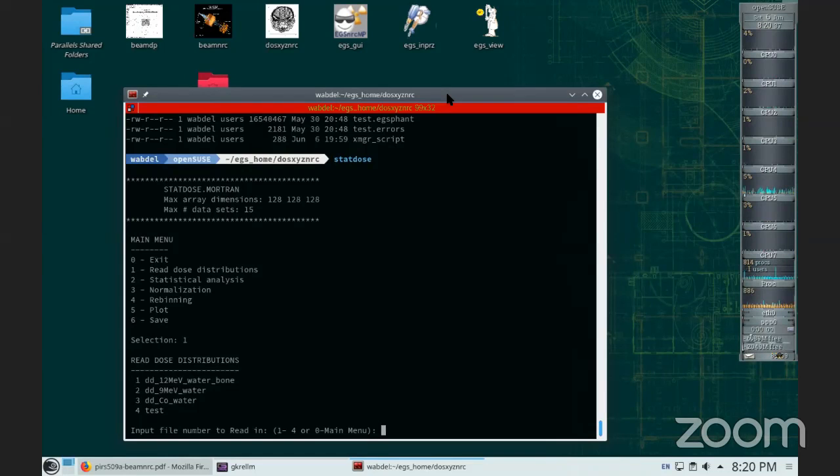We have, for example, the flattening filter. Probably a disk cannot represent a flattening filter. Even if you start thinking, okay, I'm going to stack disks with different radii above one another to generate this, it is still not a good geometry. For the jaws, we need a different shape, a different component module, or a different geometry to represent the jaws. The mirror, okay, the chamber.